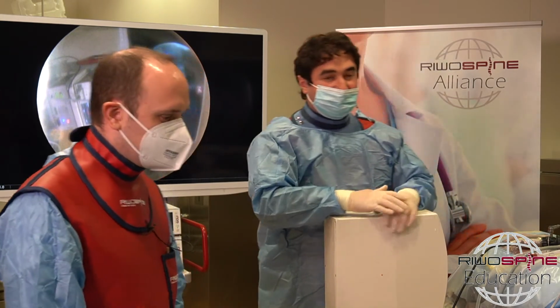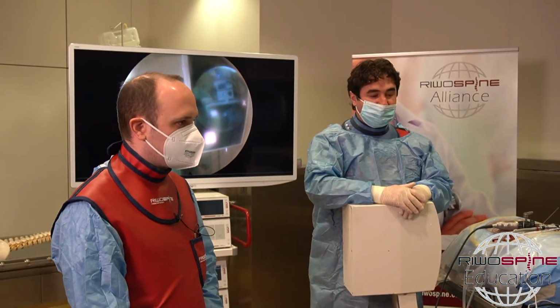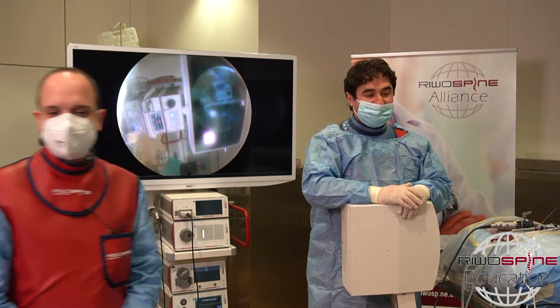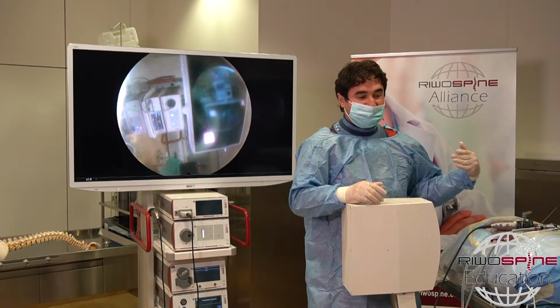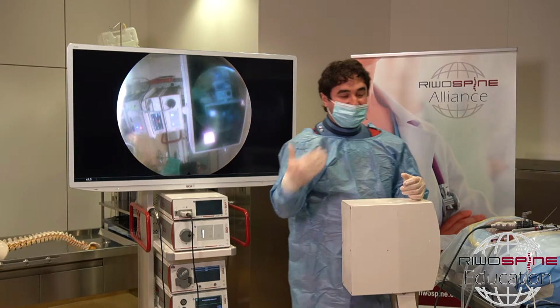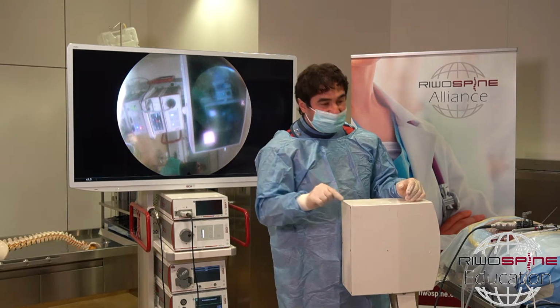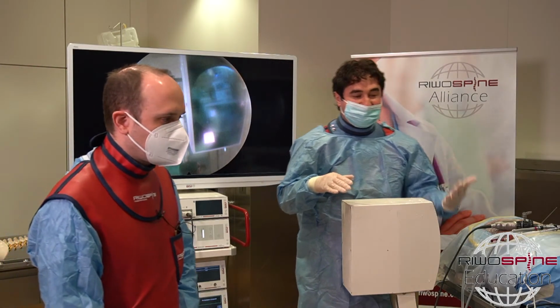Maybe some rare indications, where some surgeons prefer to reach the intraforaminal herniations at the level of L5-S1. As you know, the iliac crest is really high at the level of L5-S1, and it's not easy to reach the intraforaminal area because there is a high risk of damaging the exiting nerve root there.